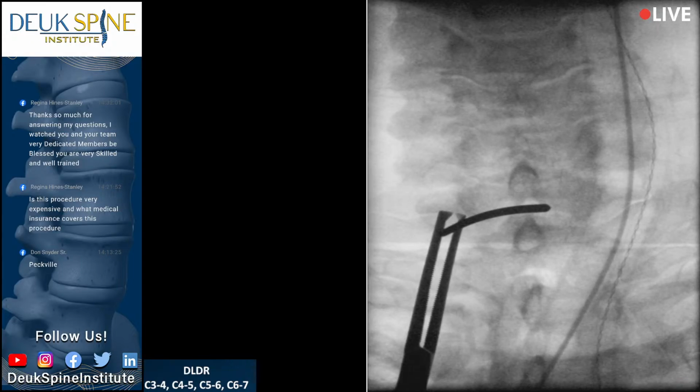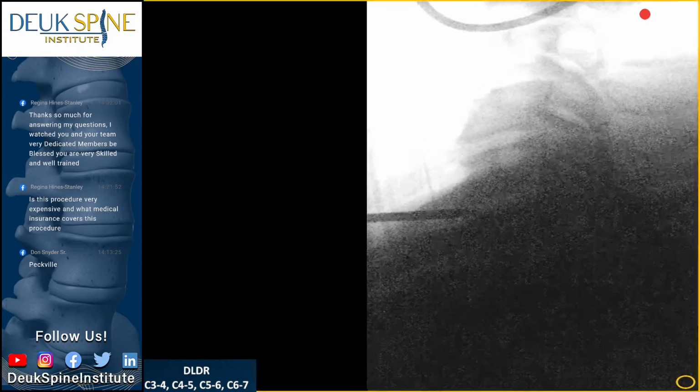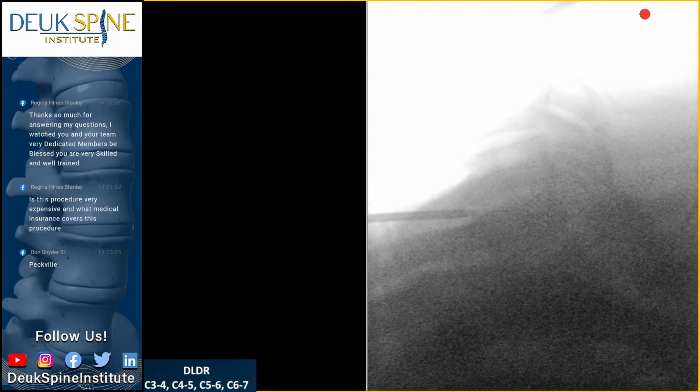All right. Let me go back to a lateral. Let me see. I wonder if I can bring this back. It's not terrible. Depends on how in I am. I'm not really in, so I need to come back up and over to the side.